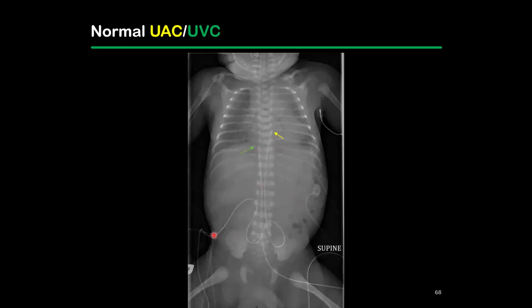Our umbilical arterial line, usually the tip is to the left of the spine if they're normally rotated and don't have heterotaxy. Another clue that it's the umbilical arterial line is that when it becomes internal, it usually takes a little course down and then will come back up, sometimes making a little V shape, because it has to come down to get into that ipsilateral iliac artery and then come back up. But here's its tip in appropriate position.